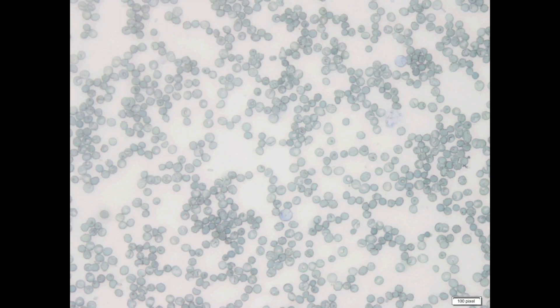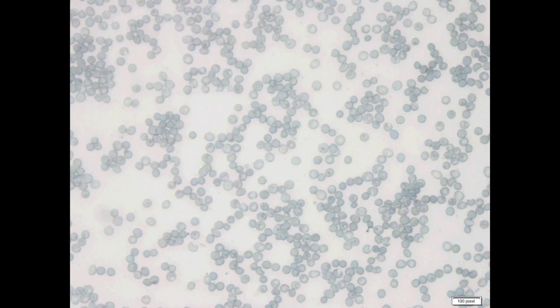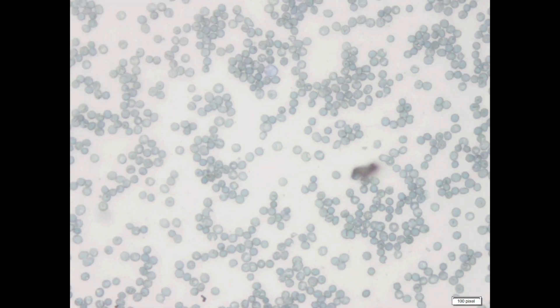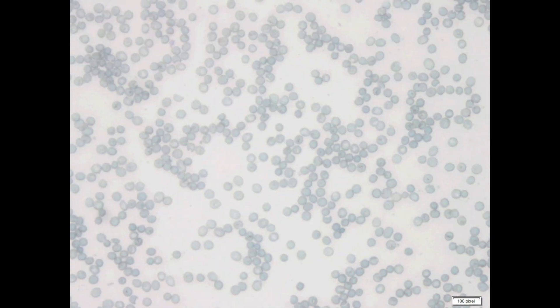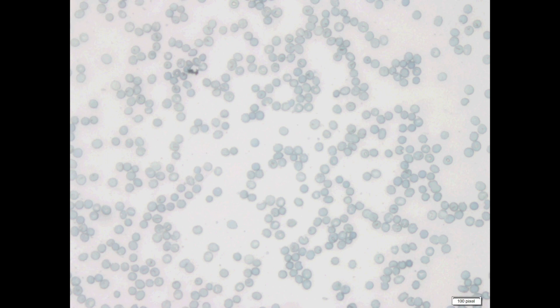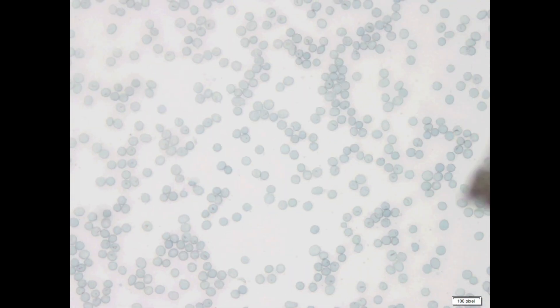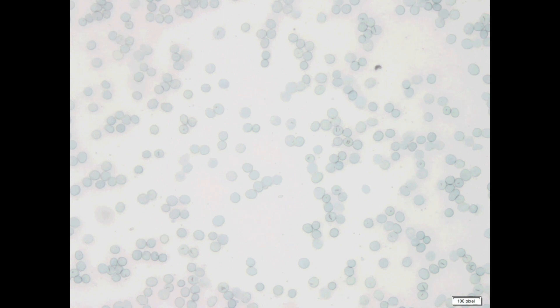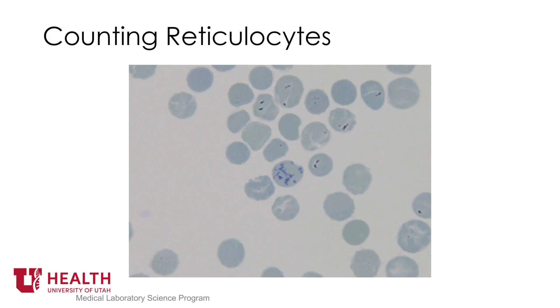Place the slide in the microscope using the 10x and 40x objective. Find an area where the cells are barely touching each other. Using the 100x objective, locate a single layer of cells and begin counting red blood cells.